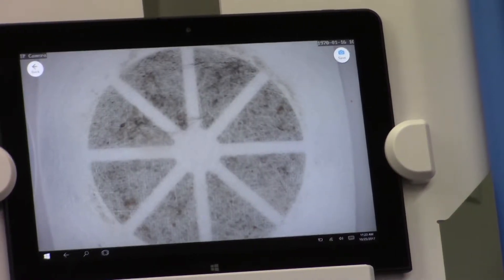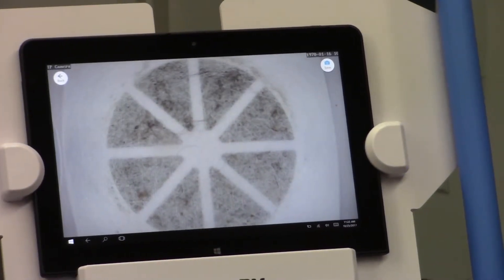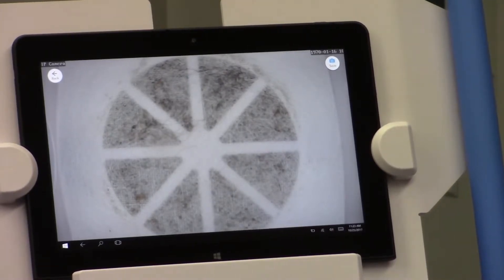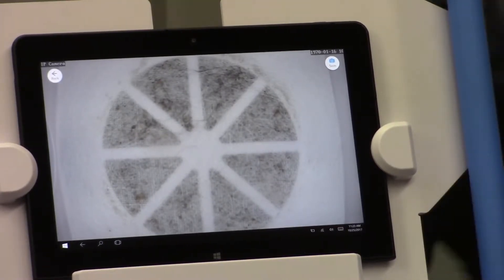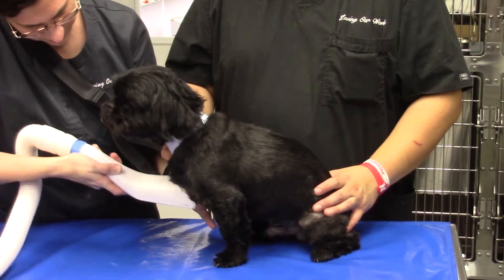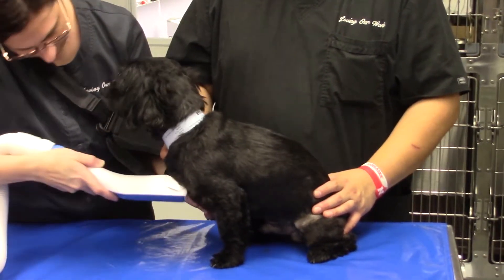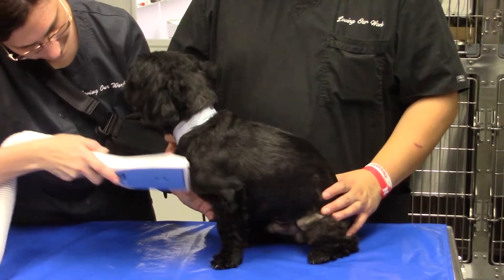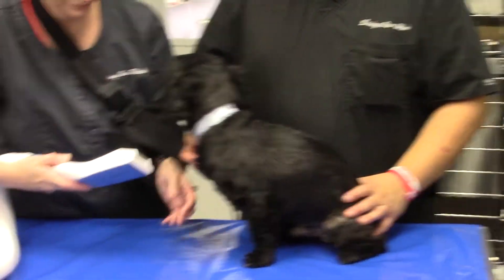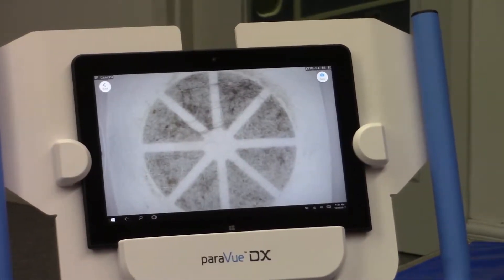Adult fleas only have one source of food, which is to suck blood, and so the droppings are actually blood clots. On this dog it would be difficult to diagnose fleas because of his hair coat and his skin color, but we do see flea dirt appearing on our iPad screen on our ParaView DX. And with some additional effort, we do demonstrate the presence of a couple of live adult fleas as well, that show up on the filter and on the screen.